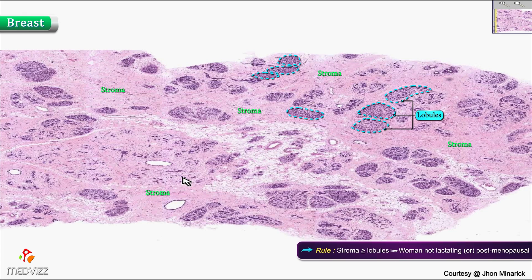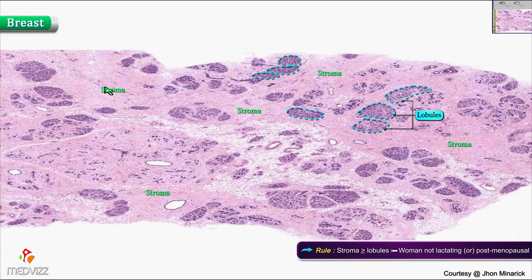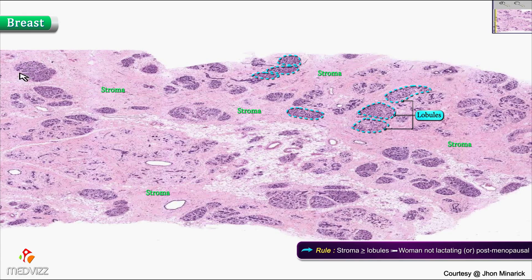The rule of thumb is that if the stroma is about the same or even more abundant than the lobules, this is probably a woman who is not producing much milk. This could be somebody who is postmenopausal. Basically, the more postmenopausal you get, the higher the ratio between the stroma and the glands or the lobules.